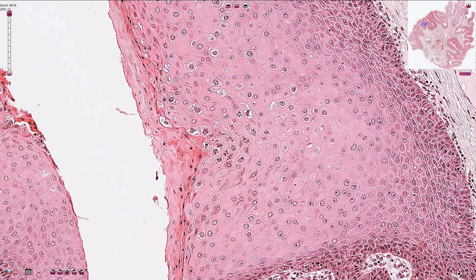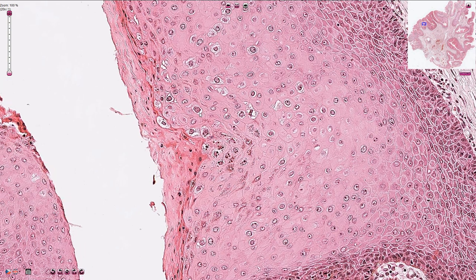Koilocytes are cells with a slightly irregular, slightly atypical, larger nucleus with a halo in the cytoplasm around the nucleus. All of these cells are koilocytes. This is the morphological effect of active viral infection.